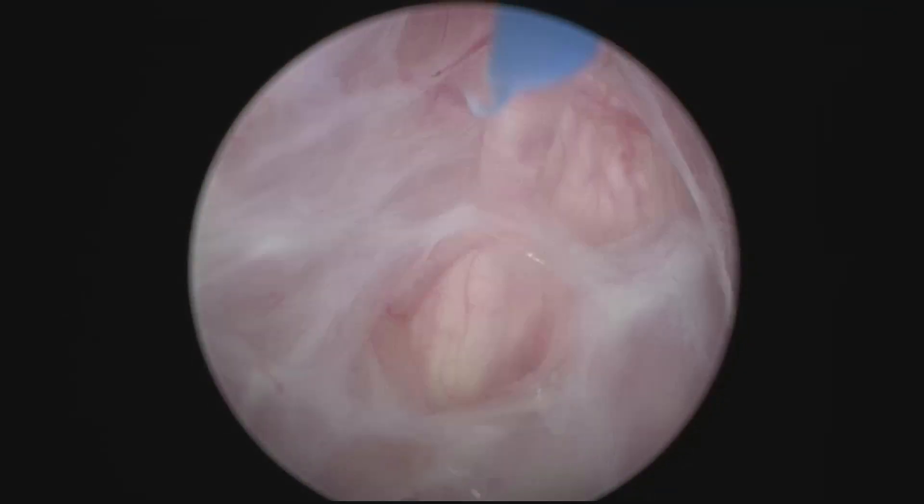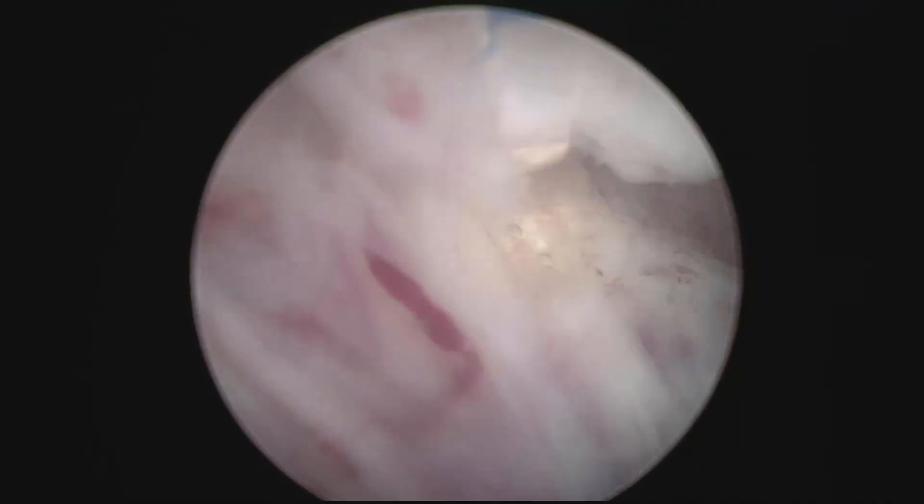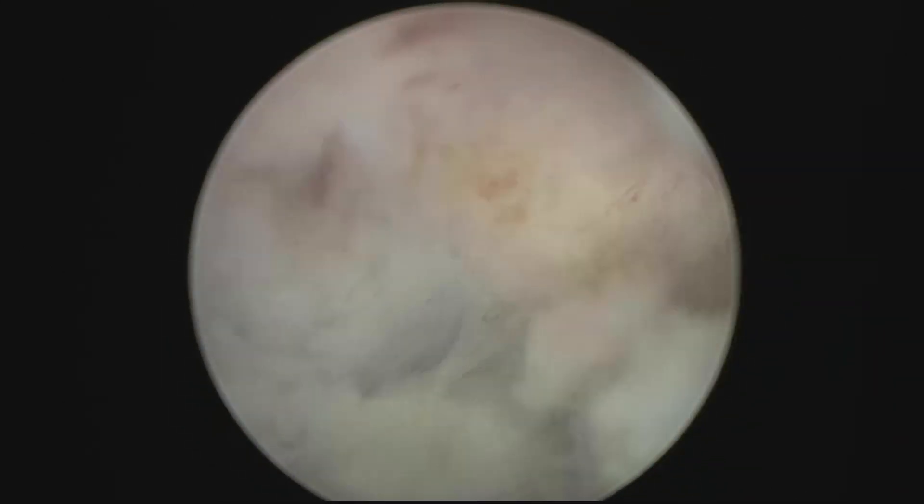You can see that now we progress a little bit following the right plane, trying to come up at 12 o'clock and join the dissection on both sides. This is the trickiest part of the operation, the part that can take longer — maybe 10 minutes or so. Then once the sphincter is totally liberated, the rest of the procedure is a piece of cake. It's very easy.